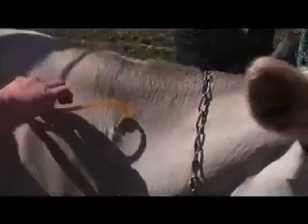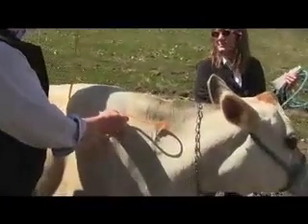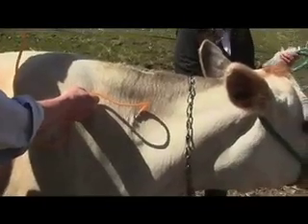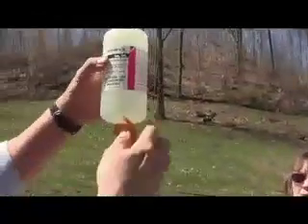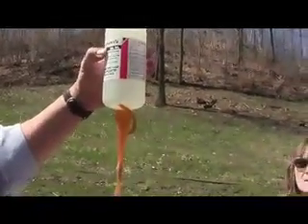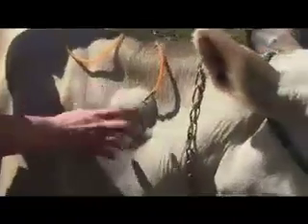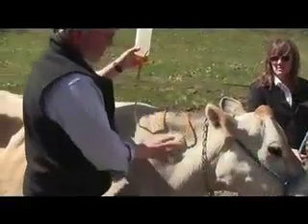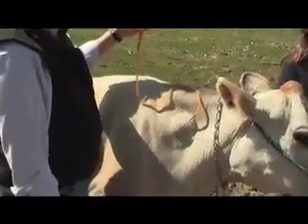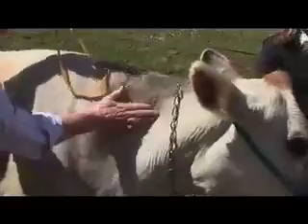You'll begin to see the pocket of calcium forming. Look for the bubbles to make sure that the calcium is flowing through the vent. The flow is slow. This is the calcium going in under her skin and she'll absorb this over a period of hours. It's a low-dose way to do it and it eliminates any risk associated with calcium injections. Work that down.